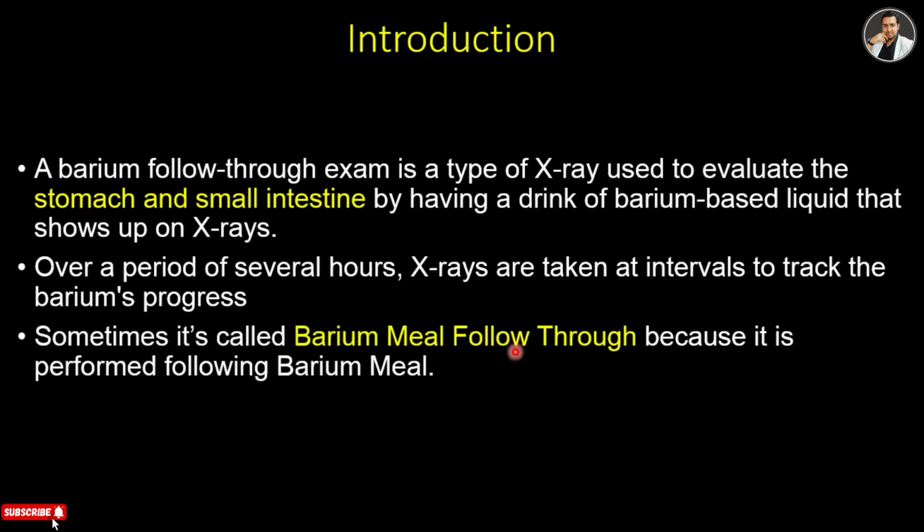And sometimes it's called barium meal follow through because barium meal is also taken with the follow through. So the doctor can advise barium meal with follow through and also can advise only barium follow through. But you have to take barium meal also during the follow through. Start with the barium meal and then followed by barium follow through. And the small intestine or small bowel ends at the ileocecal junction. So the last line is saying this.